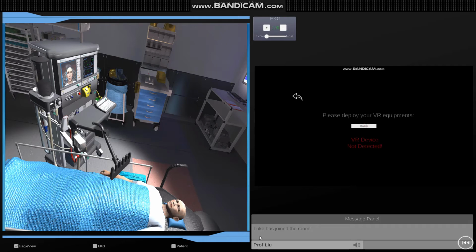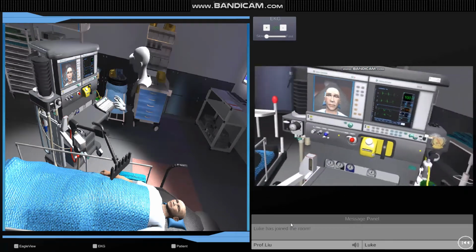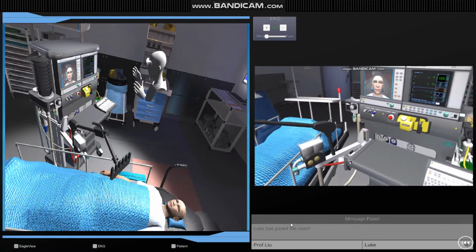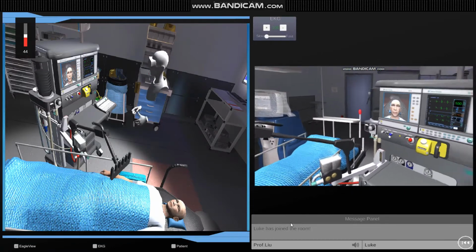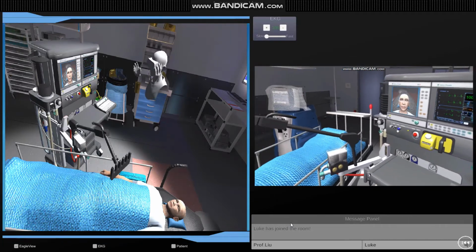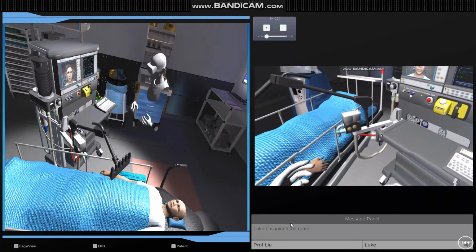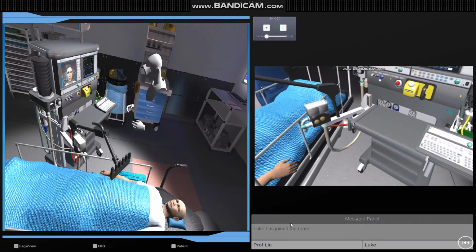I just set up a room and my student is logging into the room. Hello? Yeah, hi, I can hear you. Okay, so let's start. My name is Luke. I'm a student, and I'm trying the VR mode of the VR simulation as a student.